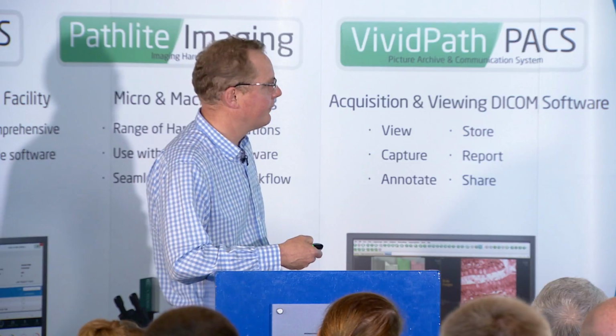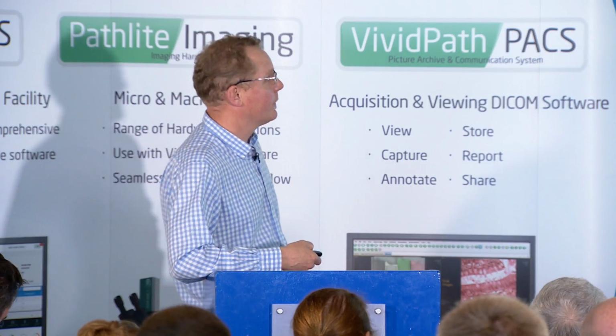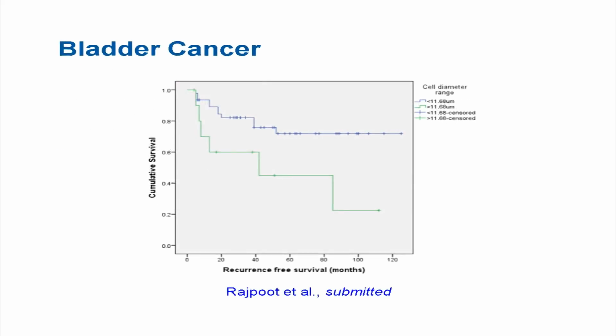But if you told them about it and then you trained them how to do it properly, then you got somewhere. You got some consistency. And this is now completely embedded in breast oncology treatment the world over. This grading system. So we've taken these elements of this grading system and looked at each individual area really to produce a tumour grading tool which can be used.